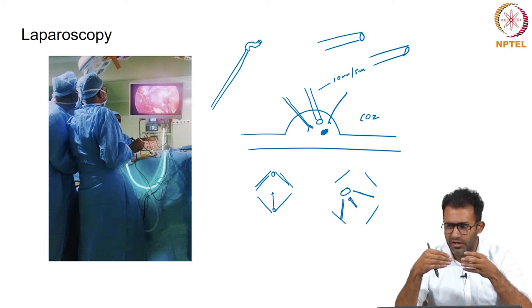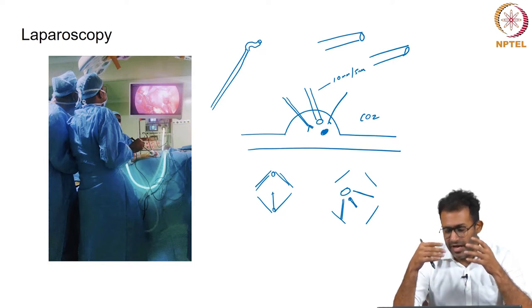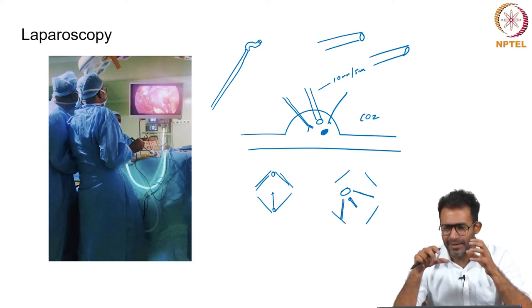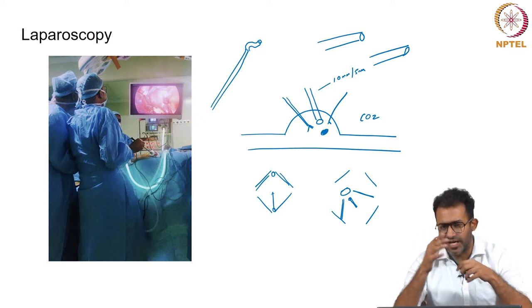So technology is moving in the way to take minimal access surgery further. I personally feel that minimal access surgery itself is a misnomer, because it's actually maximal access. The entry is small, but the access you get is quite maximal. So it's taking laparoscopic surgery towards newer frontiers. We are able to come as close to open surgery as possible, along with the advantages of open surgery, such as tactile sensation.